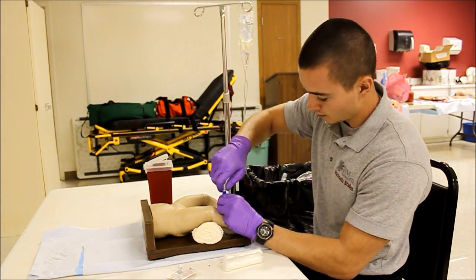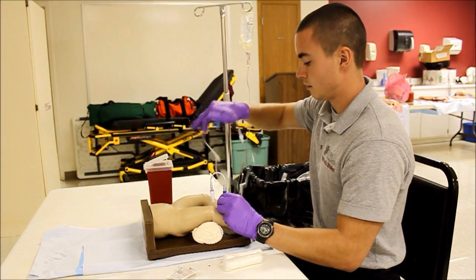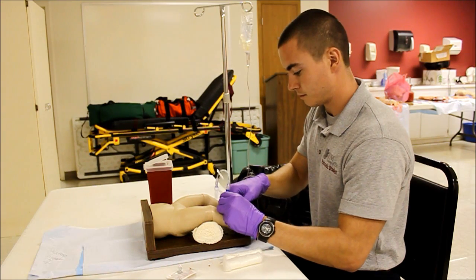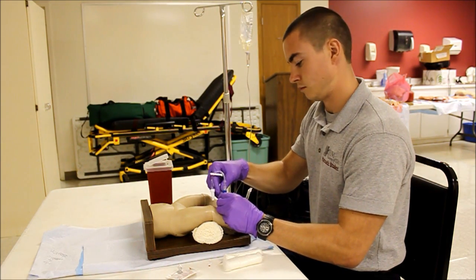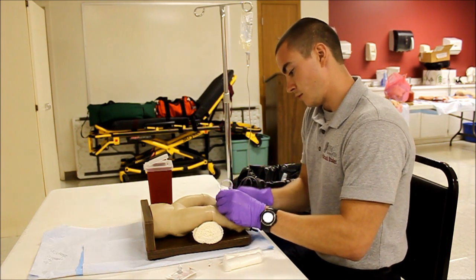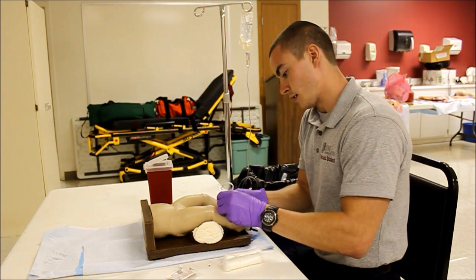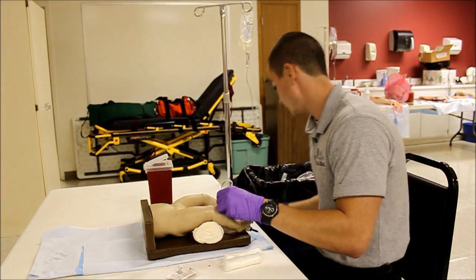I'm going to go ahead and attach my stopcock. Then I'm going to go ahead and attach my administration line. Making sure not to let go of my needle, I'm going to attach my line and open it up to make sure that it's flowing.